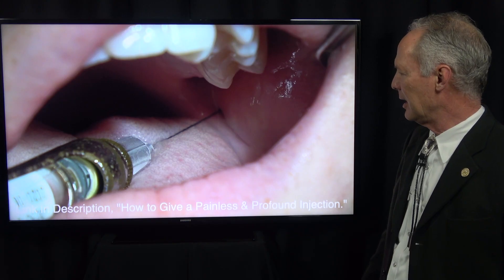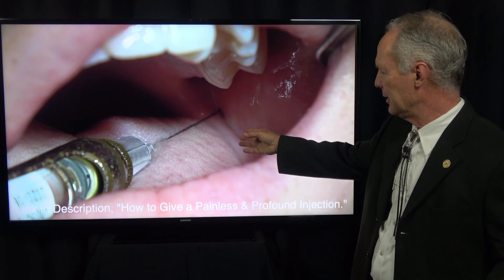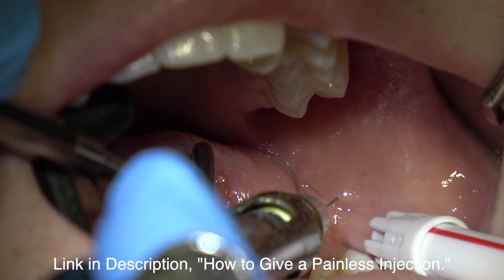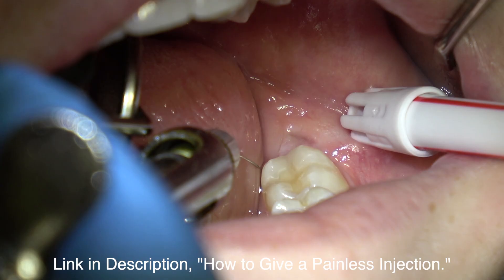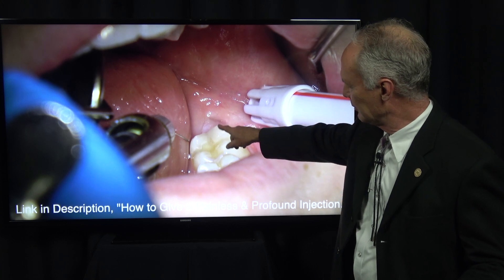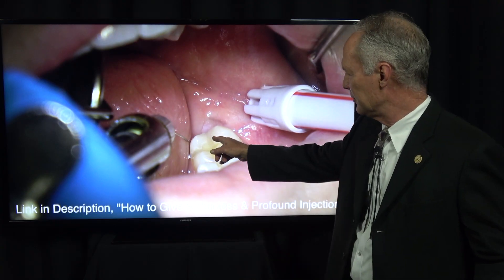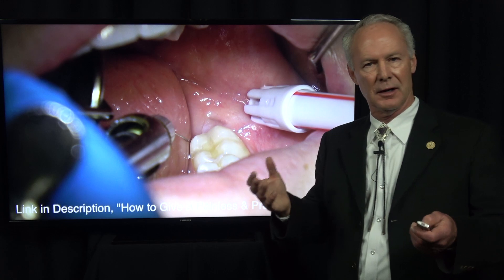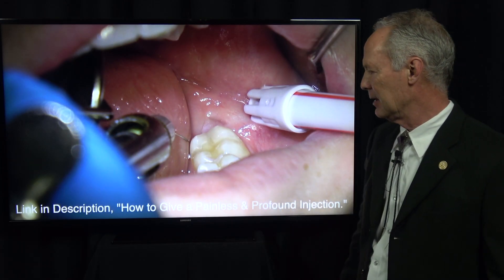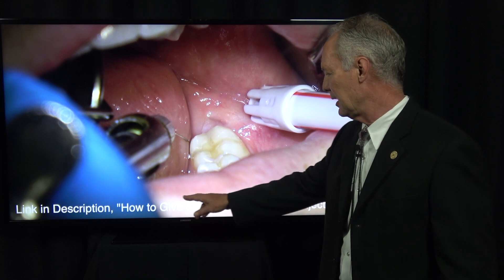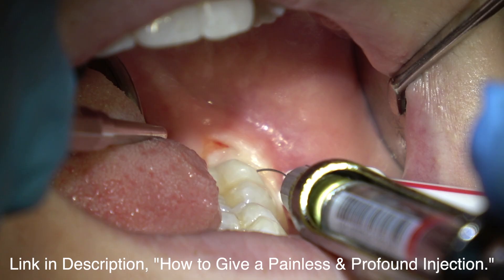I'm giving a nerve block as well as intraligamental injections. Watch the video on how to give painless and profound local anesthesia. Same thing — a long buccal injection, and then injecting into the periodontal ligament space around the wisdom tooth. If you're having trouble getting profound anesthesia, you're not giving intraligamental injections. Always, if you're extracting a tooth, doing endodontics, crown preps — anything of significance — give an intraligamental injection. I'm giving it on both sides.